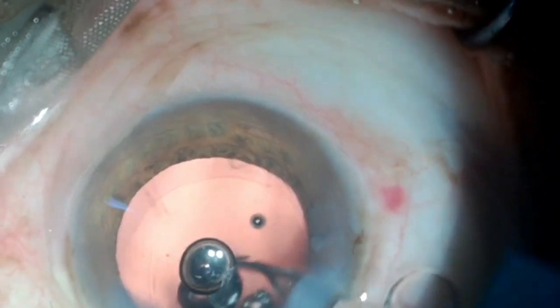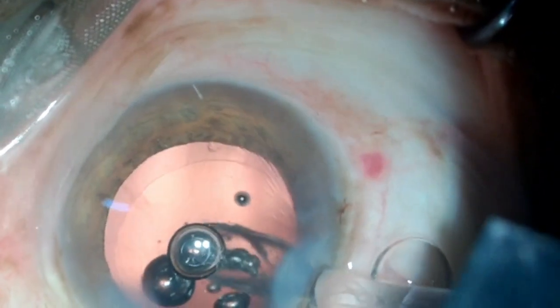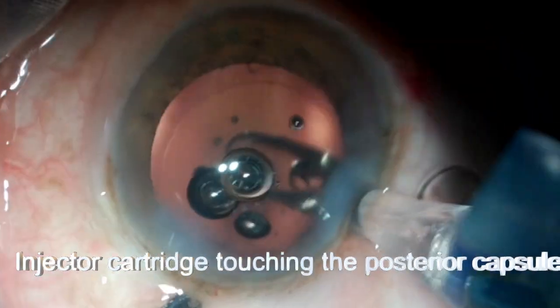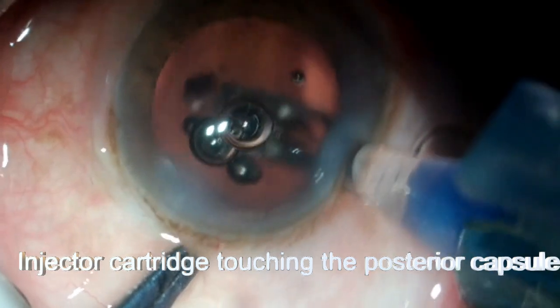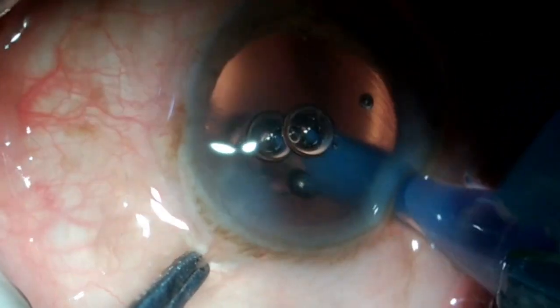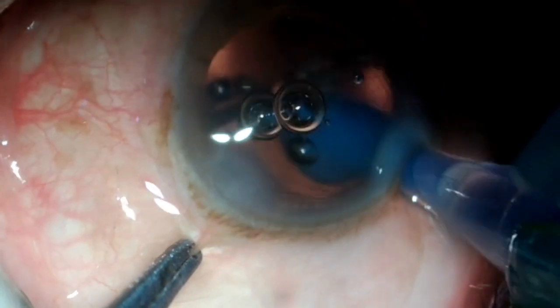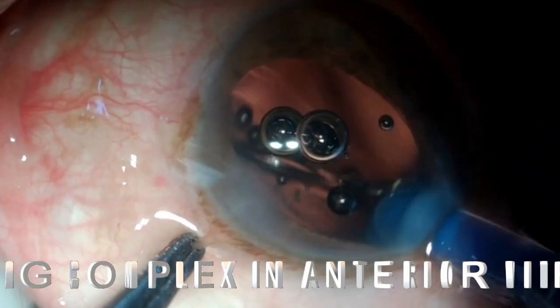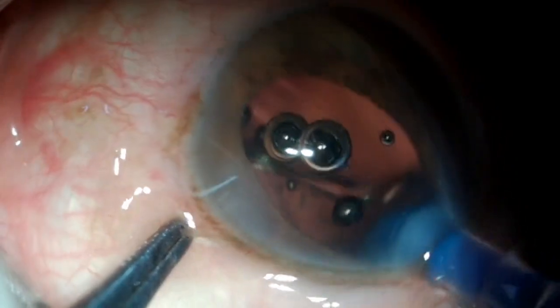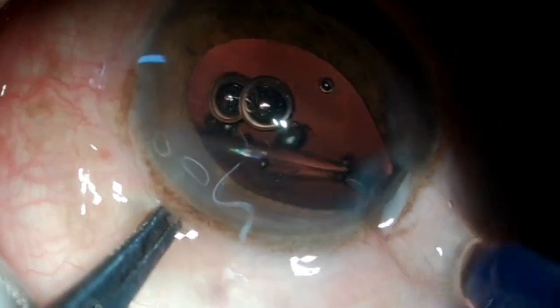Here is a case where a novice surgeon is operating, where you can see the tip of the IOL injector touching the posterior capsule, and the IOL is injected so forcibly that the IOL along with the bag got dislocated into the anterior vitreous.